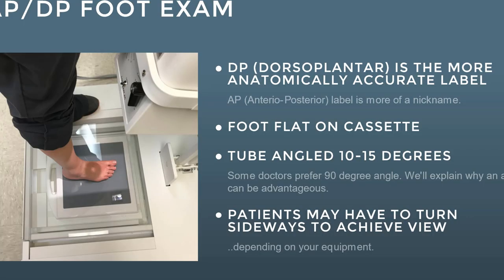For the DP/AP foot exam, the patient stands on the cassette with feet shoulder-width apart, equal weight distribution, facing forward. The camera is already angled at 15 degrees rather than shooting straight down. We center right in the middle of the foot, and collimate the x-ray light to close in the field and reduce excess radiation to the patient. Place a right marker inside the light field, off to the side of the foot.